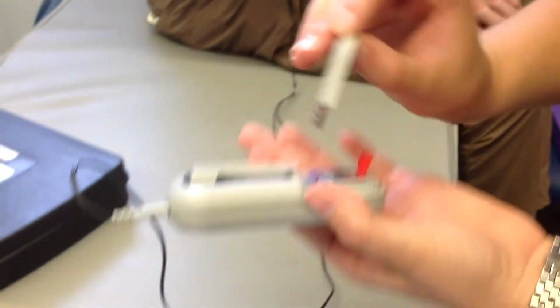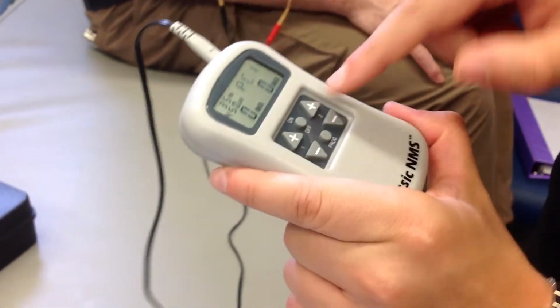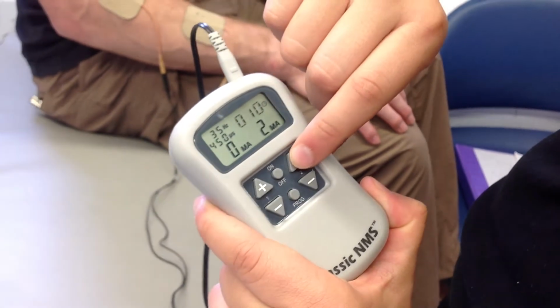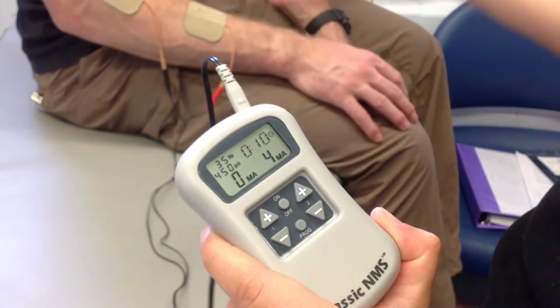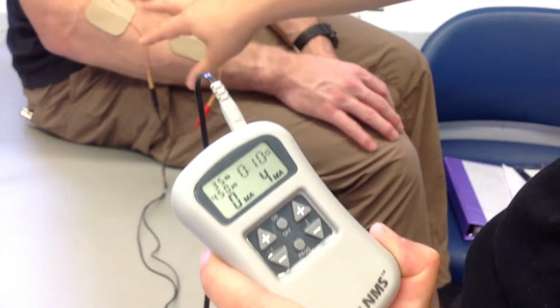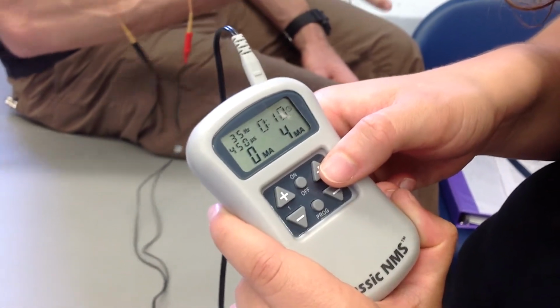So then you can put this back on, and since this is this channel, I use this arrow to turn it up. And you just ask the patient when you start feeling contractions, and you keep turning it up, and you're looking for the slow twitch. And you only turn it up when you see numbers, right?